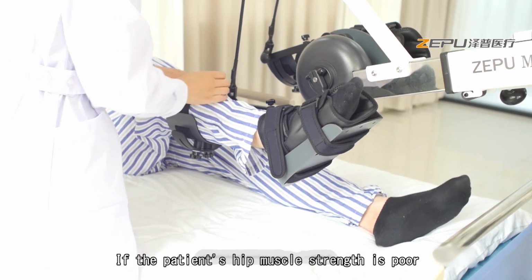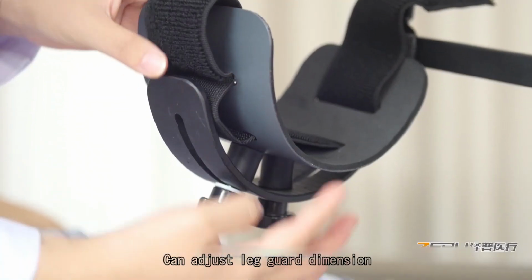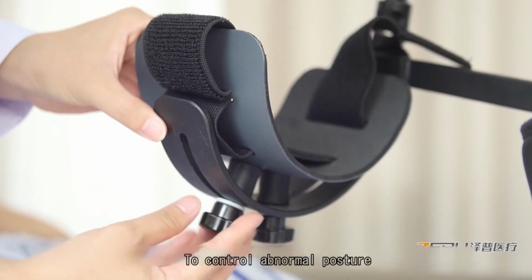If the patient's hip muscle strength is poor, or hip abduction and external rotation is severe, the leg guard dimension can be adjusted to control abnormal posture.